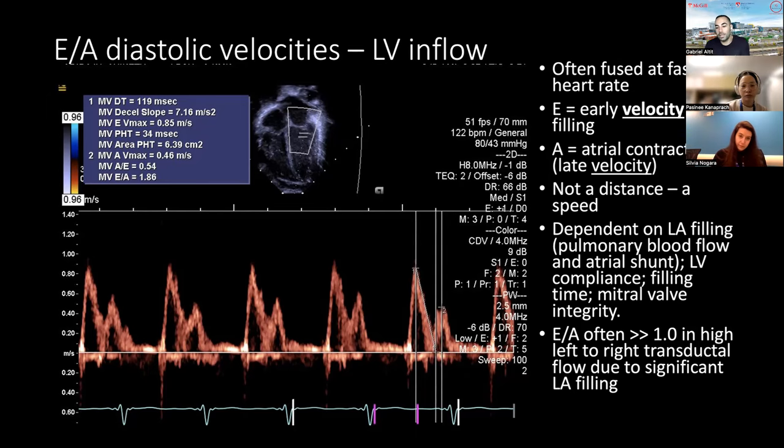Preemies, their ventricles are going to adapt, they're going to become more compliant. So this marker is a good marker for the first few days, but when you get to 36 weeks, it's not true anymore. Their LV is supposed to be compliant. So this ratio is supposed to be above one.